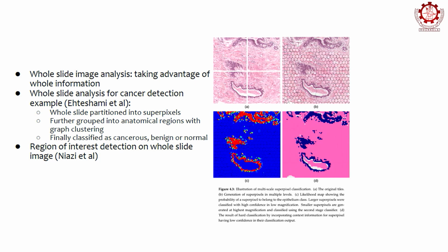So you take your image and you construct these super pixels. You see these honeycomb-like structures here. These are all super pixels. All the pixels inside a super pixel share some similar information, whether it is intensity, orientation, or entropy. So you construct these super pixels, and instead of doing your analysis on the pixels, you can do your analysis on the super pixels also. So that's something that can be done.